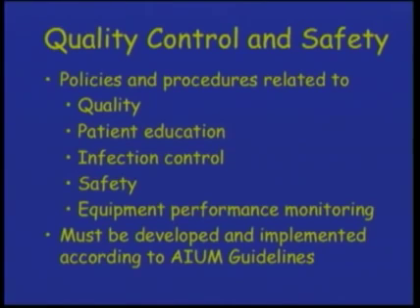Policies and procedures related to quality, patient education, infection control, safety, and equipment performance monitoring are all a part of those guidelines, and they must be developed and implemented according to the AIUM guidelines. So there are additional guidelines telling us how to sterilize our transvaginal probe, for example, and about safety beyond what we've gone over today.